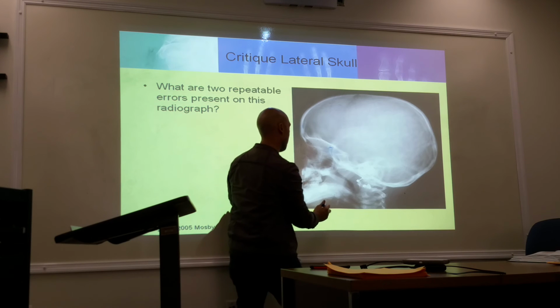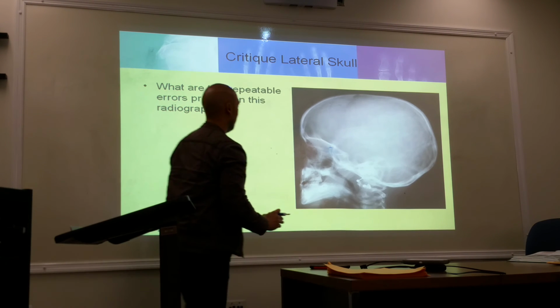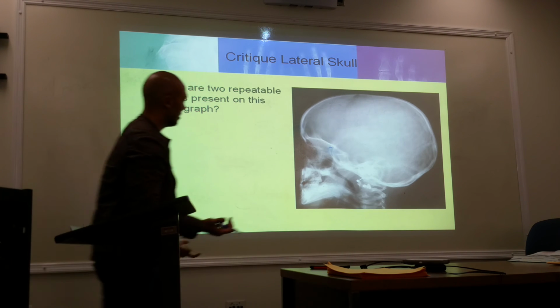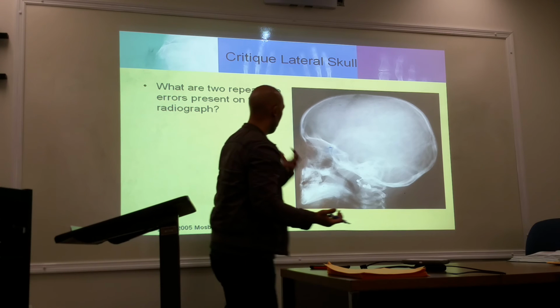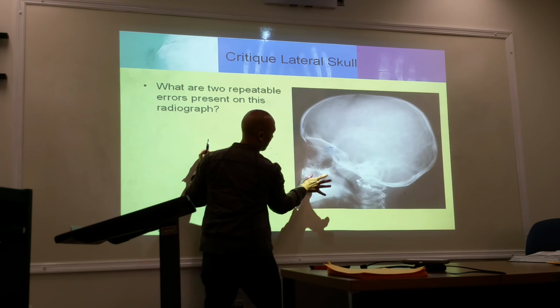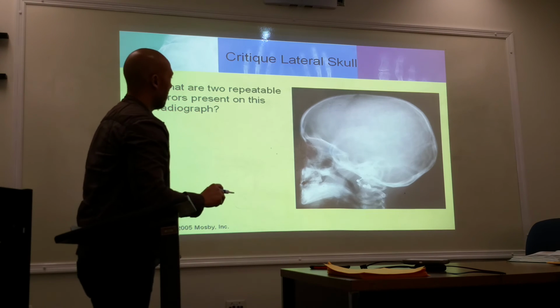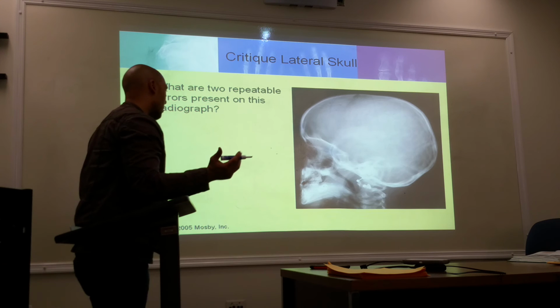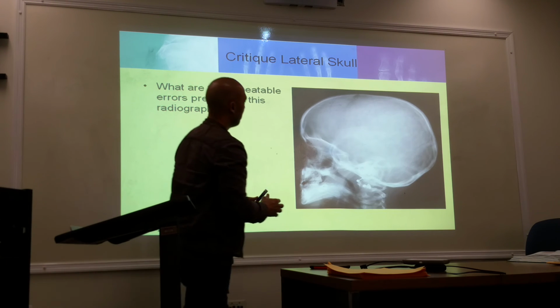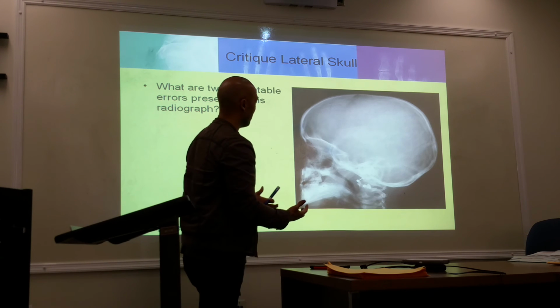So there's an artifact, an earring there. What's this? Some hair ornaments. Whiskers? Those are the hands. So there's movement. It might be somebody just holding this girl's face during the study. How do you know it's a girl? I don't know if it's a girl. You're right. But the main thing here is there is a lot of movement going on.